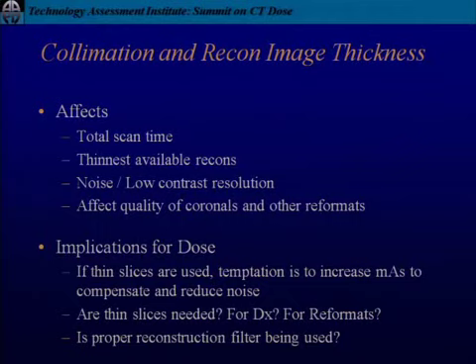Okay. Mike, I want to thank you and both gyms because you do an amazing job on this. And for people that haven't done this and they're looking at those calculations going, all right, feed per rotation per second, how many scan times, that is our world. We live doing that all the time. Is 10 seconds enough? 15 seconds?